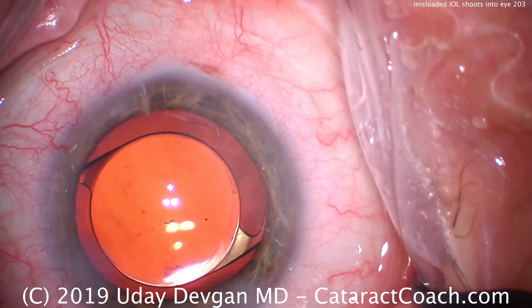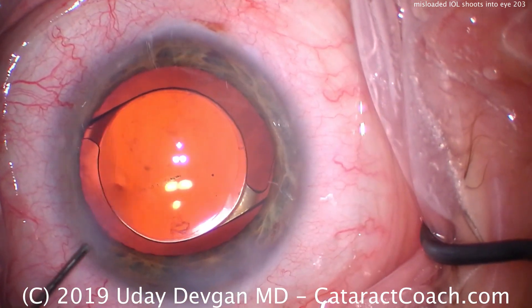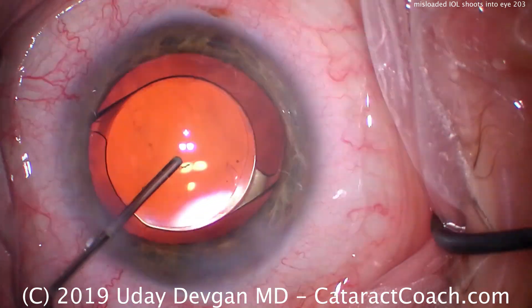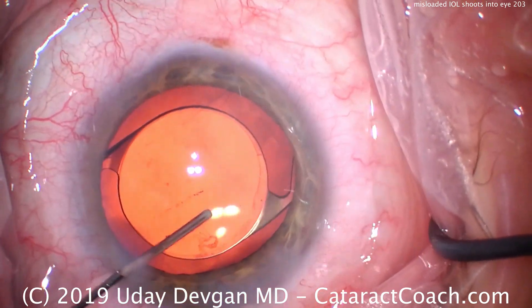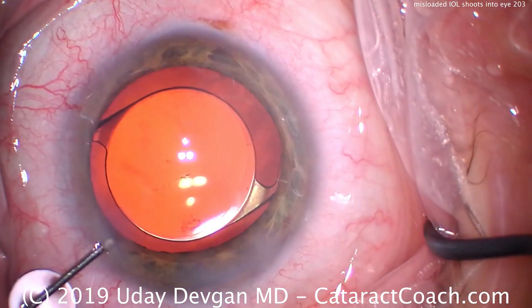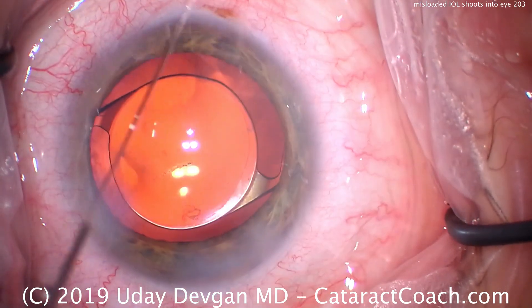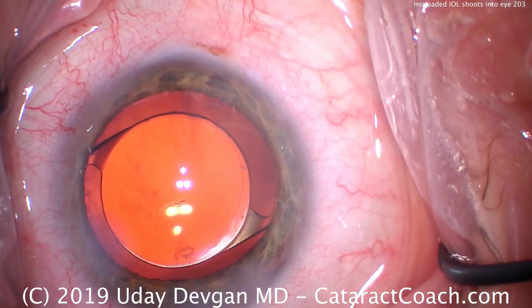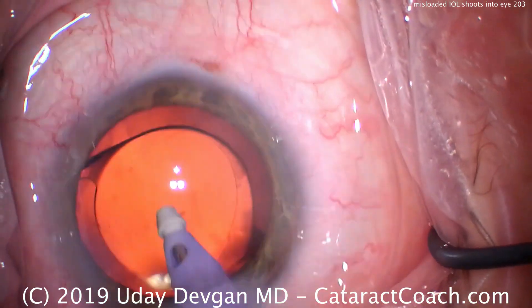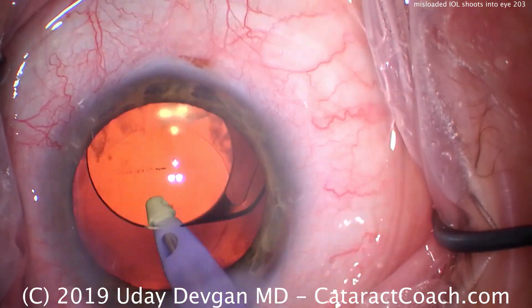Now the question is, what about that line there? Can we do anything about it? Are we sure it's on the optic itself? Is it in the optic or is it behind the lens? Well, one way to know for sure is to go inside the eye and try to aspirate there. I know convincingly that it's within the optic material itself, within the acrylic. But just to be sure, we'll go underneath here, lift up the optic, and you can see we can vacuum there.